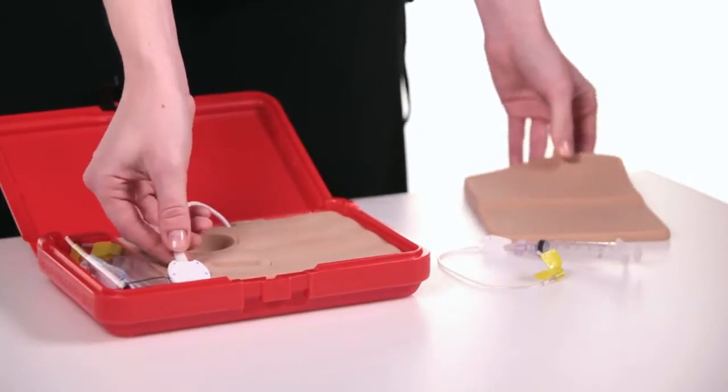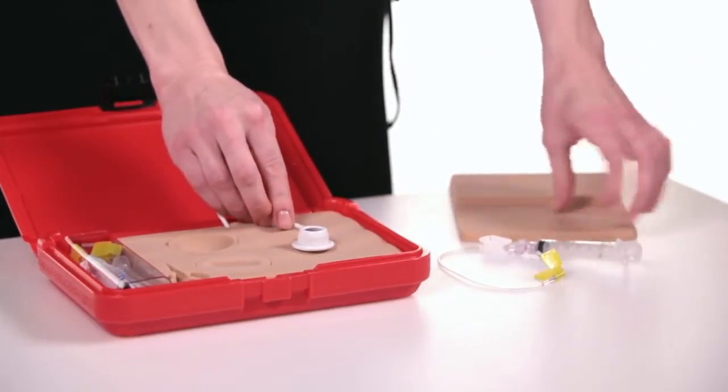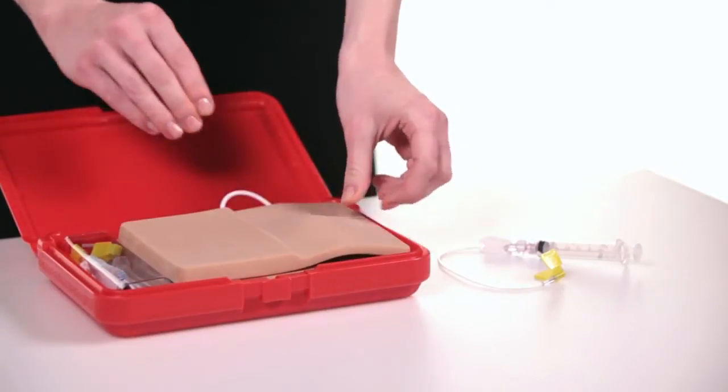The supplied port is removed from the storage area and placed on the underlying soft tissue block. The skin flap is placed over the port and the port can be palpated.